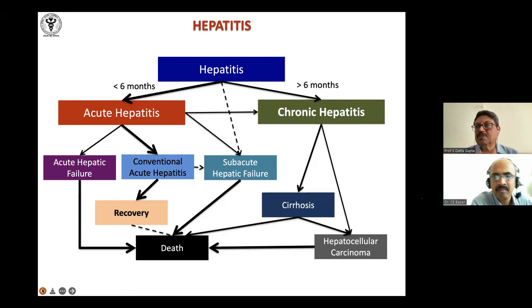Thank you. The next question is, how to identify the zones? Is zonation more of a theoretical concept, or is it used in practice? There is no line that says this is this zone and that is that zone. It is an approximate thing, like in the stomach if you want to divide it into three areas, one third, one third, one third. It's something like that.